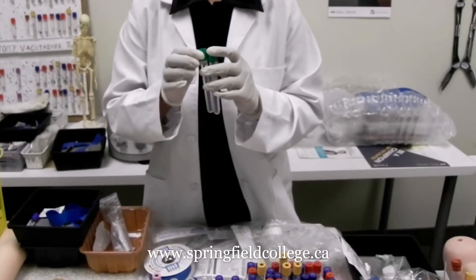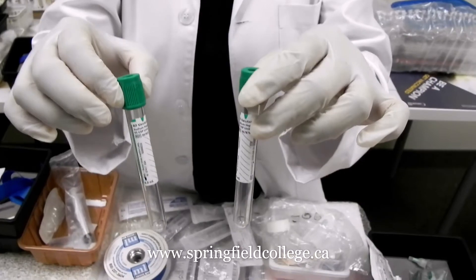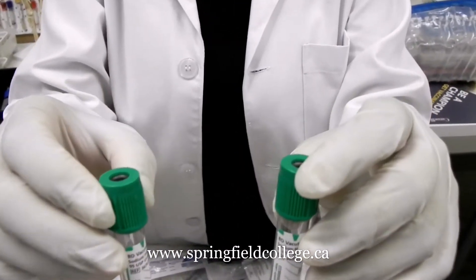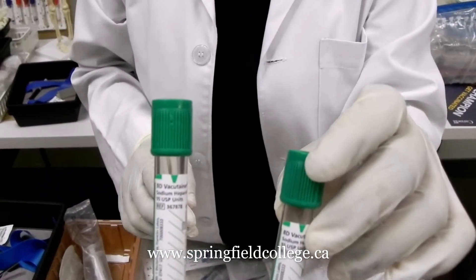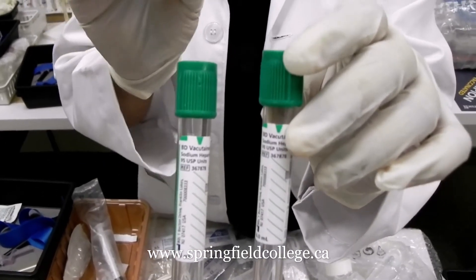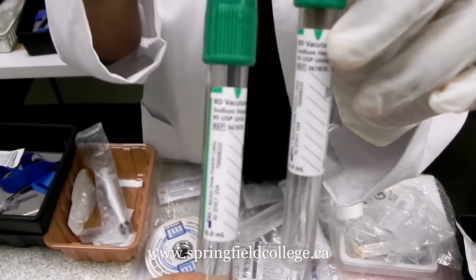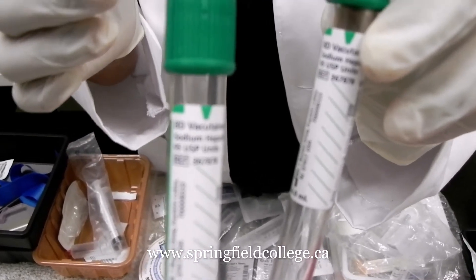Another tube I am going to show you is the green top tube. Easy to remember: green means heparin. This tube is for chemistry as well.